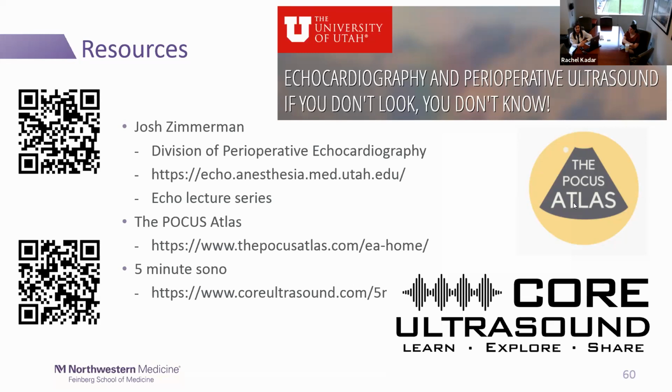In addition, I've learned that while I might have difficulty obtaining all 4 images perfectly, there's generally at least one image that I can get when the patient's supine. For example, if they're supine and intubated, getting that parasternal long and parasternal short is sometimes almost impossible, but a subxiphoid sometimes comes in very clearly. So I also teach the residents: if this is the only image you get, how can you get as much information as possible from that one image?